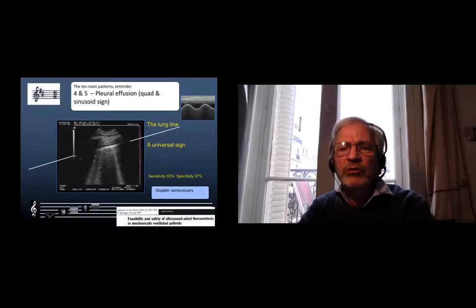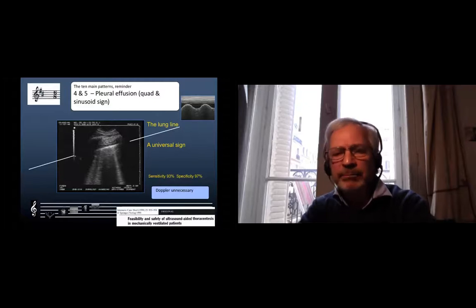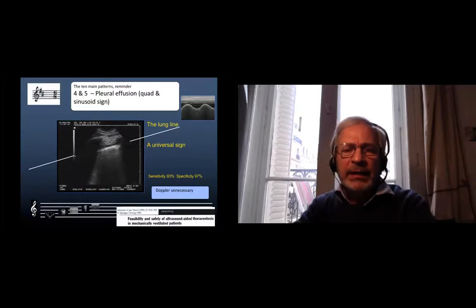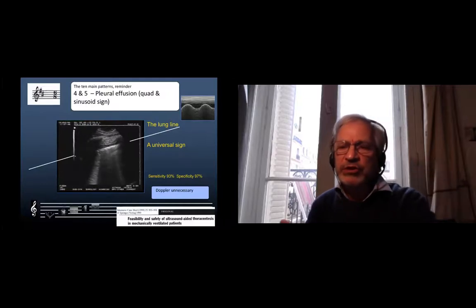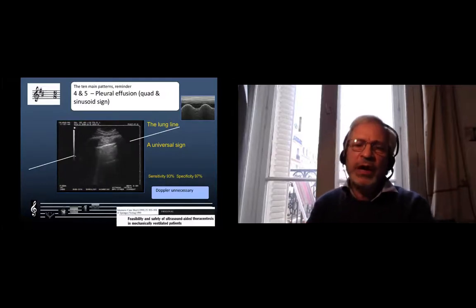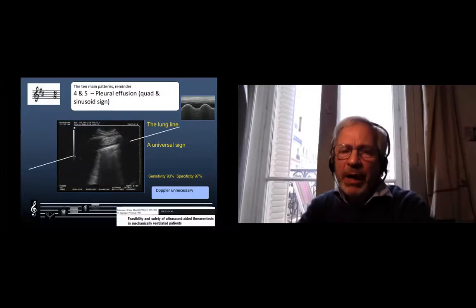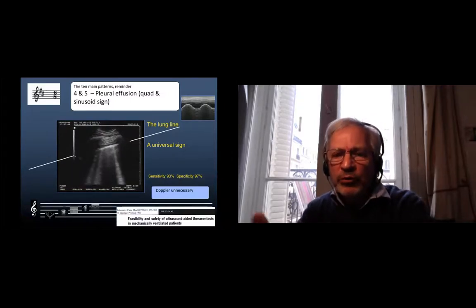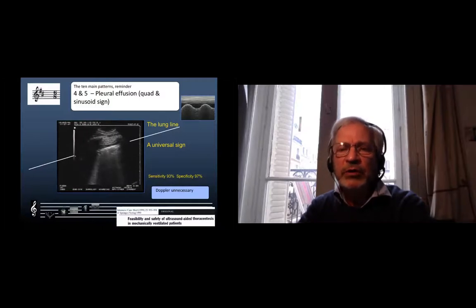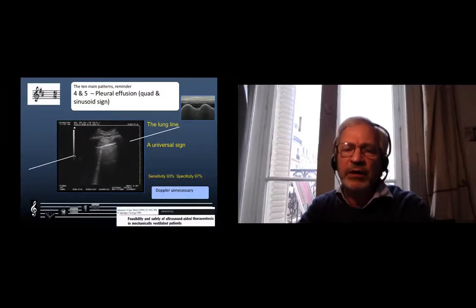Which shows the quad sign mainly. That is, we see one line which is bright which is not the pleural line but the lung line, which is parallel to the pleural line and moves toward the pleural line on inspiration, making the sinusoid sign. No need for Doppler.